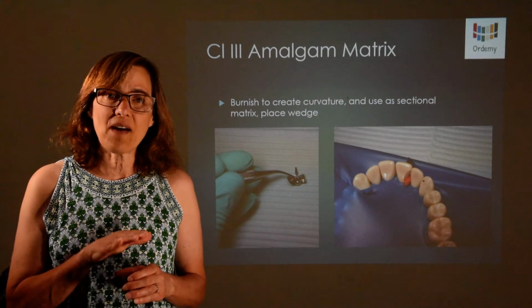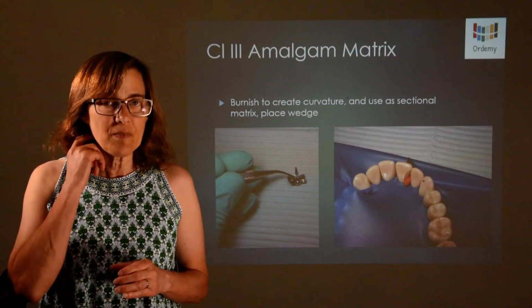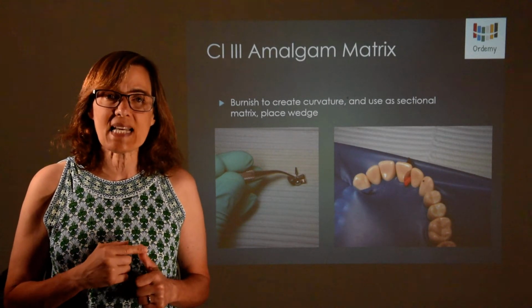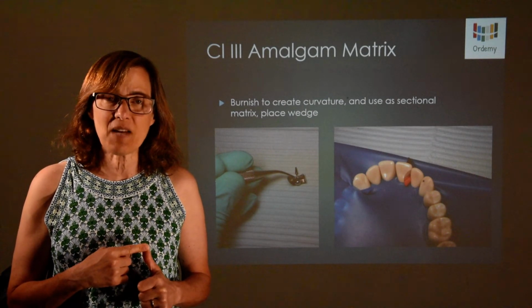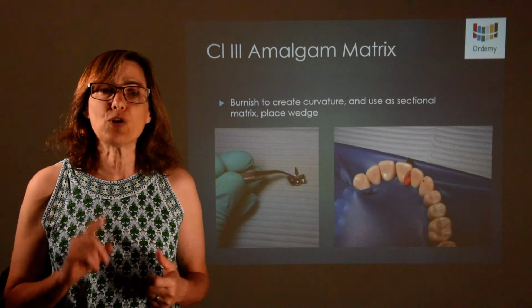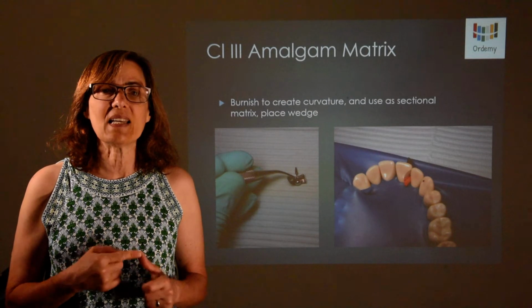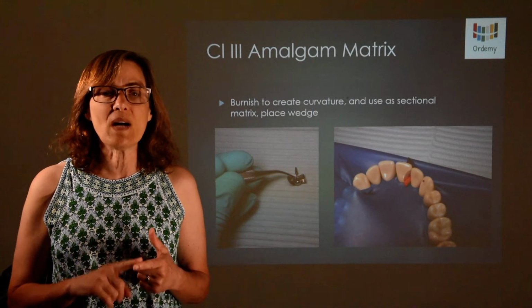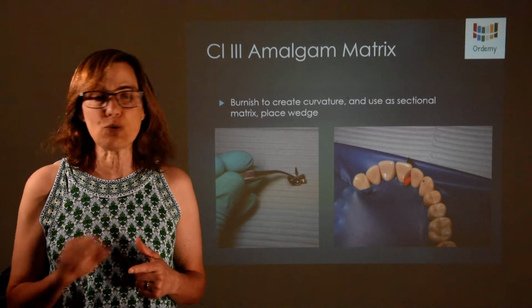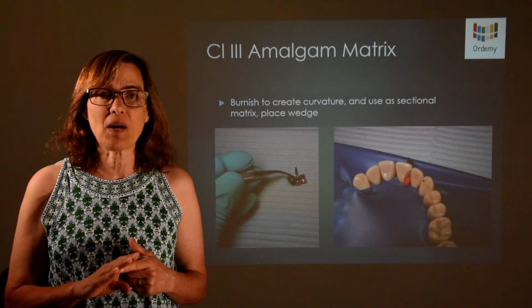Once you have the entire tooth filled with amalgam, there is normally a setting time. There's an initial setting time of the amalgam, and then there is a final set of the amalgam. You will be working with the amalgam completely in the initial setting. Once the amalgam starts going into the final set, you do not want to be touching the amalgam.